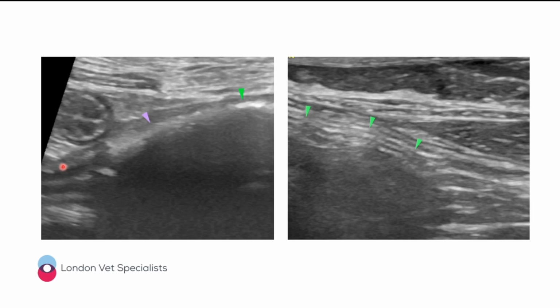So mucosa, submucosa, muscularis, and serosa. So there's no doubt at all that this is small intestine. We've got this hyperechoic, curvilinear structure with beautiful, strong, uniform shadowing. So this is definitely small bowel. This is definitely shadowing. This patient definitely has a small intestinal foreign body.